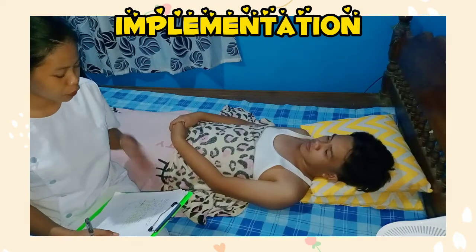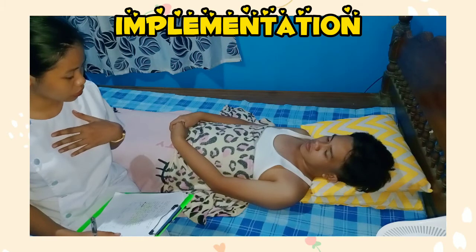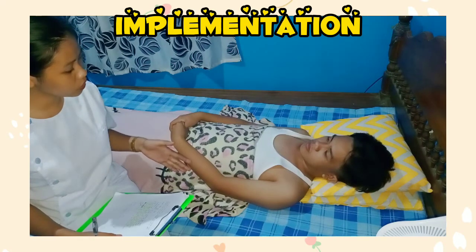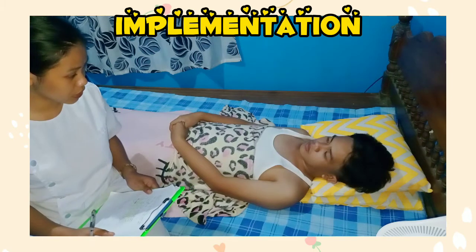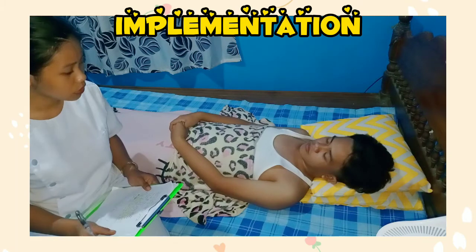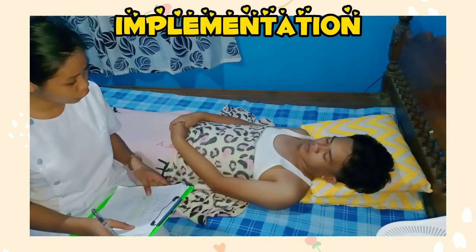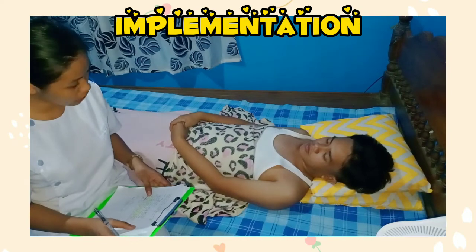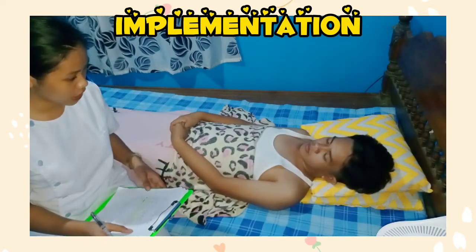Good day, I am Jocelyn Carbonell from Nueva Ecija University of Science and Technology, and I will be your student nurse for today. So, can you please state your name, sir? Jorel Carbonell. So, Mr. Jorel, I will be getting your body temperature to check how well your body can make and get rid of it. But before that, let me perform hand hygiene.